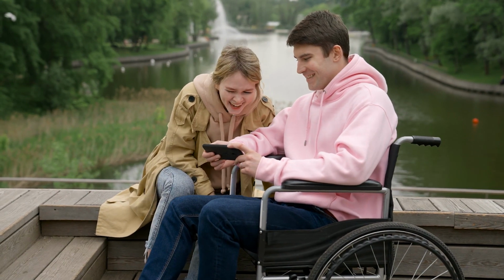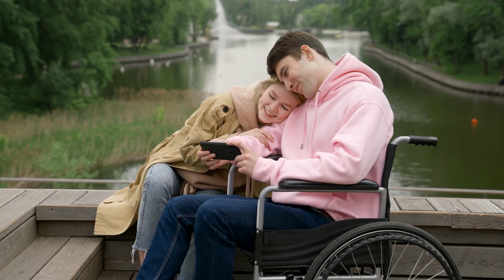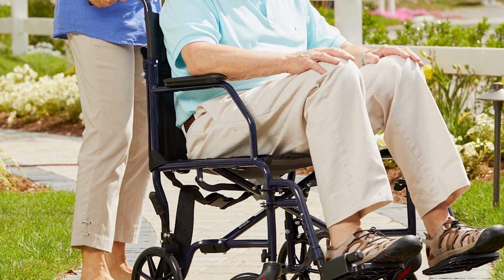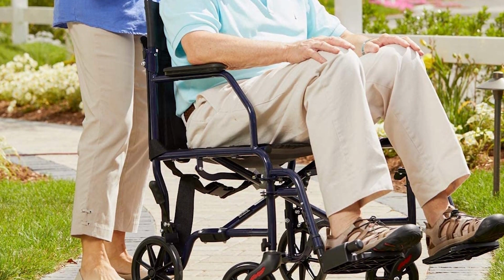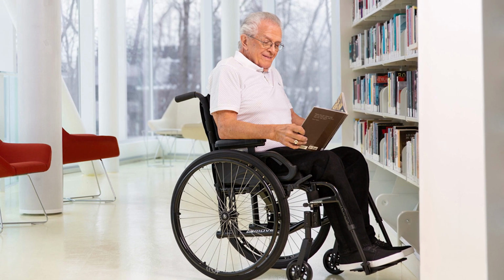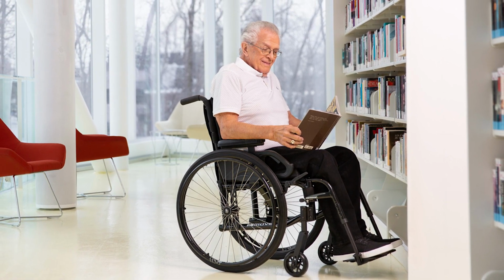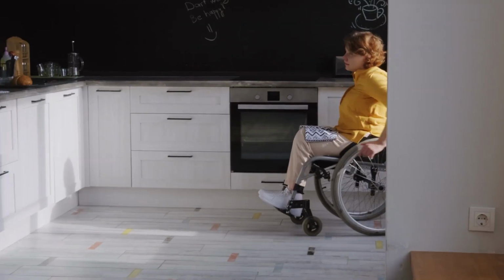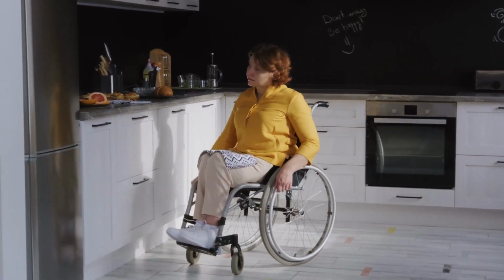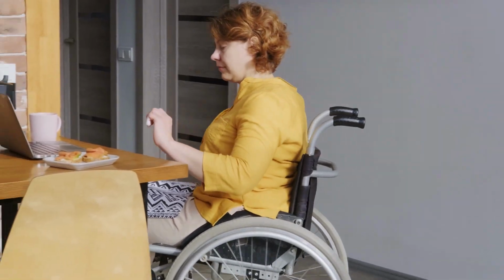For example, transport chairs may be a better choice when traveling on things like trains, trams, or buses. They can usually be folded, unlike many standard wheelchairs, and made narrow to slip down aisles and over single steps. On the whole, however, a wheelchair is still the superior option for anybody who wants to move around truly independently. It's also worth noting that wheelchairs come with more customization options than transport chairs, primarily because there is a higher demand for them as a long-term companion.